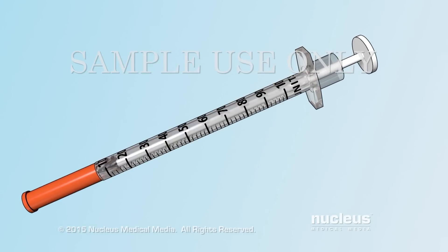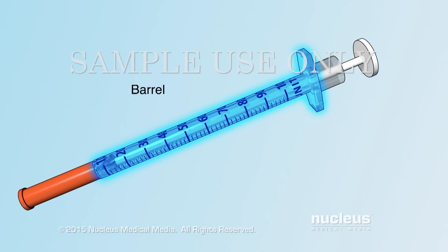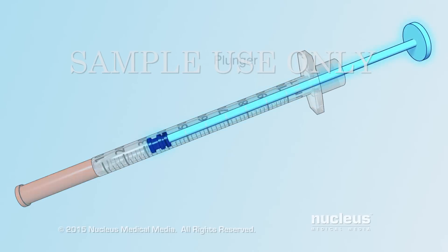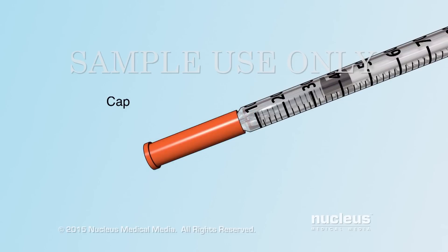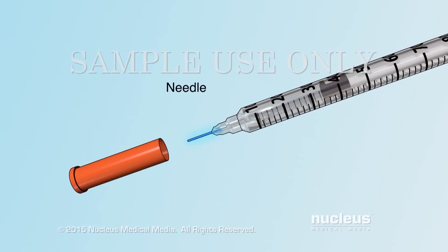A disposable syringe has the following parts: a barrel, a plunger, a needle cap, and a needle.